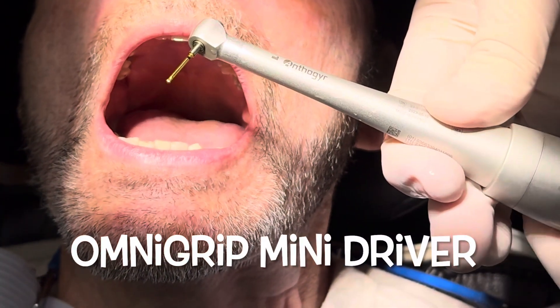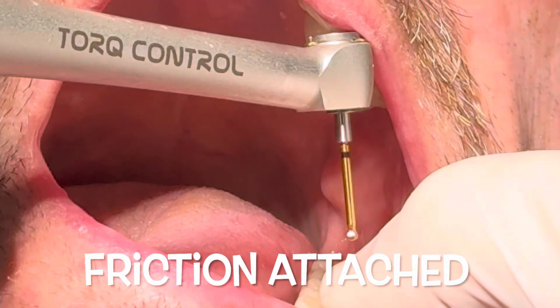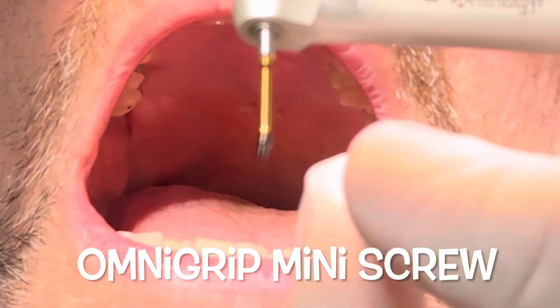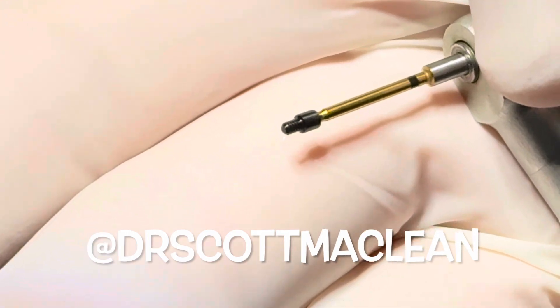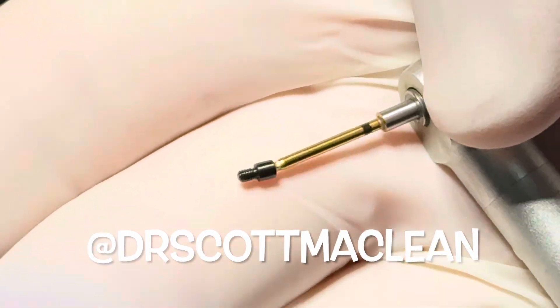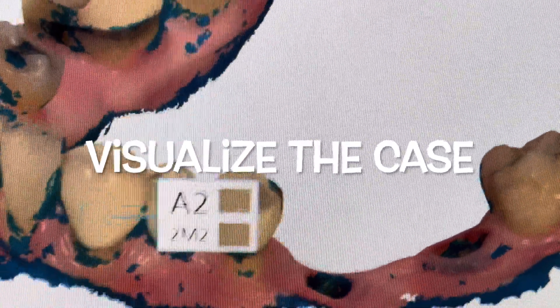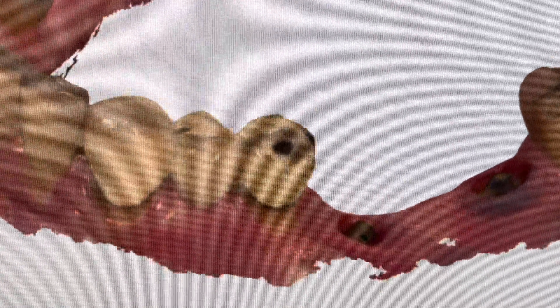Many referral doctors say they don't want to do this, but it's one of the easiest procedures. You take an OmniGrip mini screwdriver and put it in your torque control wrench — this allows you to hold the screw on the driver with an almost sticky grip so that when you carry it to the mouth you don't have to worry about dropping the screw.